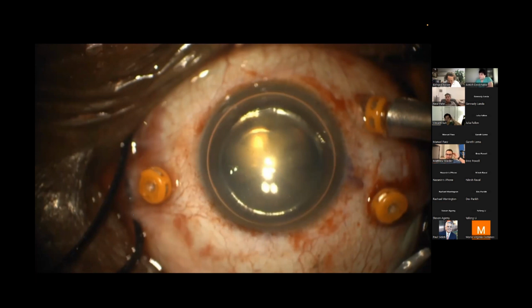And that would be if the view was so bad, like the lens became opaque. I had one case with Dr. Barash where we started with a lens that wasn't great. And just like you said, Dr. Landa, we did the biometry before because we didn't want to take out the lens in a 20-something-year-old guy. But during the surgery, it just became so bad, we couldn't see anything.